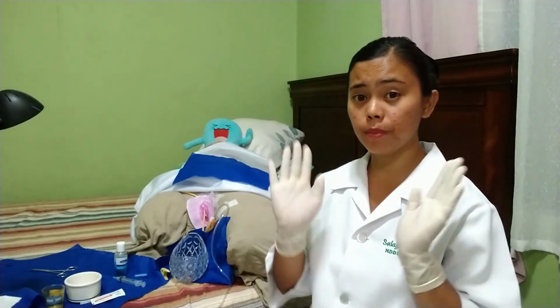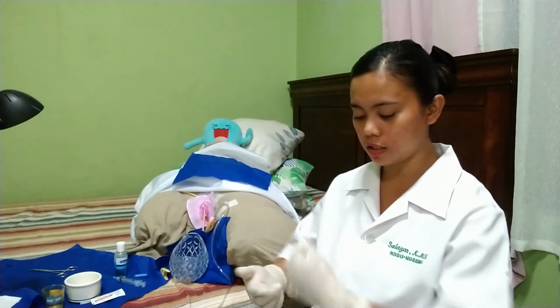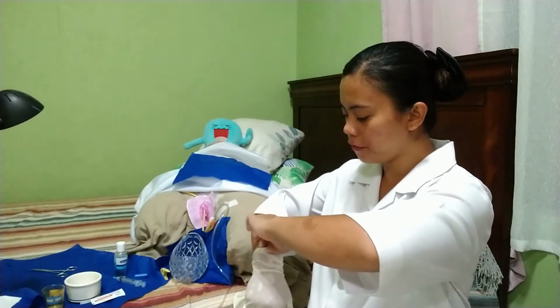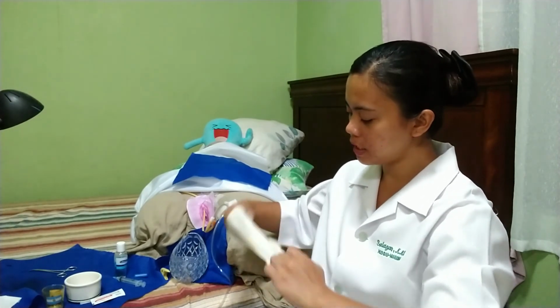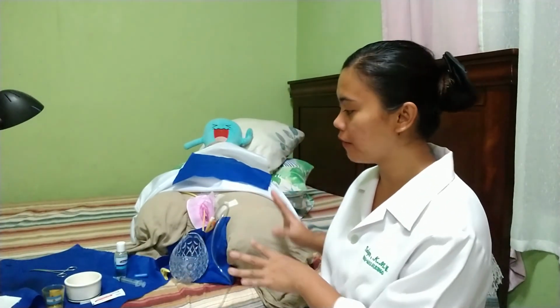The next thing to do is to remove our gloves and put the patient on a comfortable position. That way, we would prevent irritation on the scrotum of our patient if our patient is a male. Next is to remove all the equipment that we have right here, do aftercare, and wash our hands.